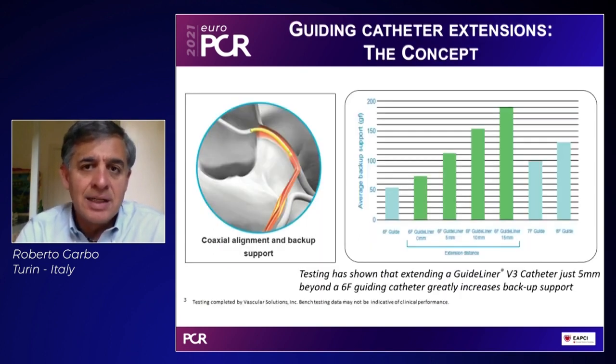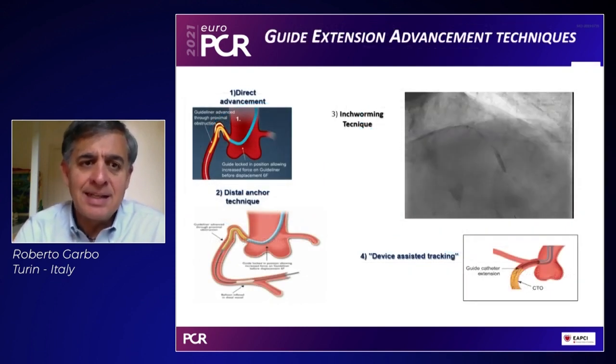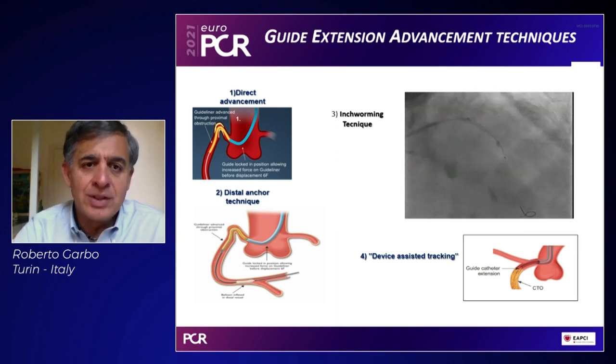We can see in this slide how important the advancing of a guide extension is to improve the support. You can see in the green cylinder in this slide that every 5 millimeters of advancing of the guide extension, you increase your support a lot. We have many techniques that help us to use the guide extension.